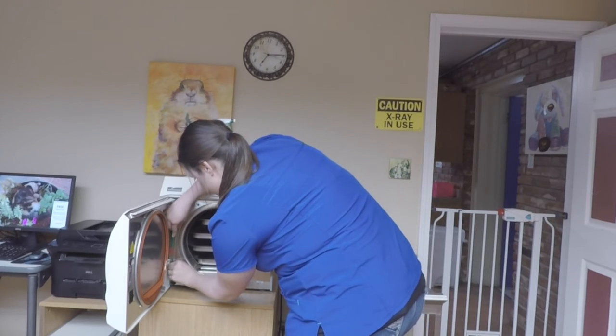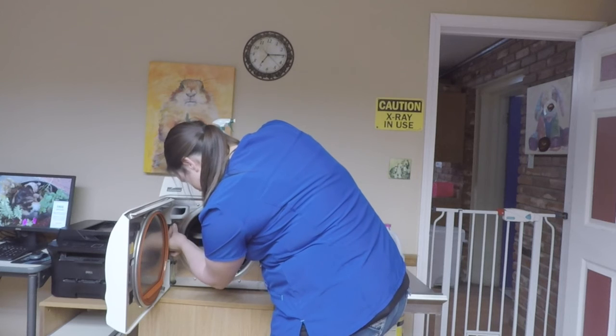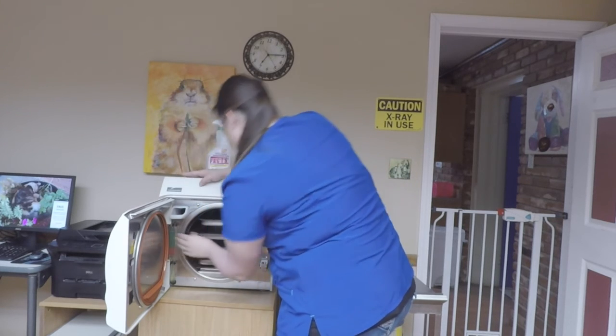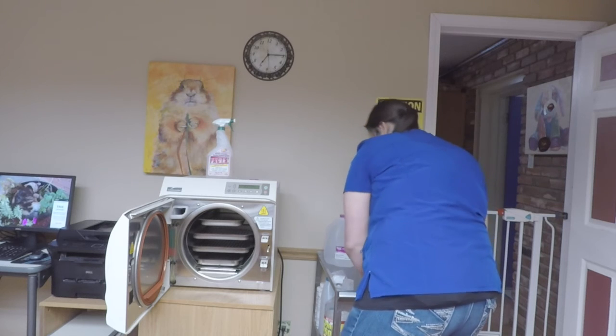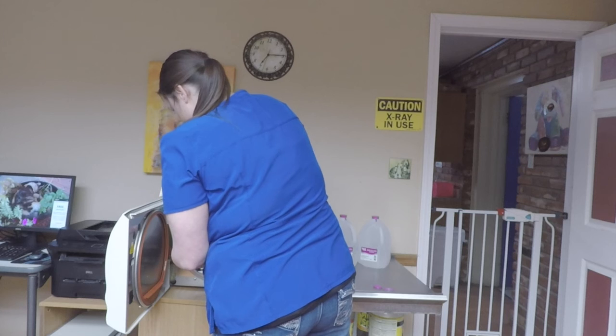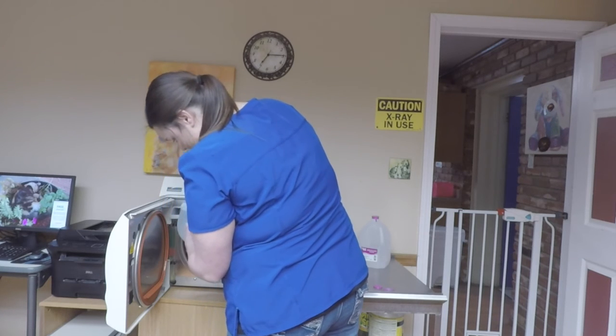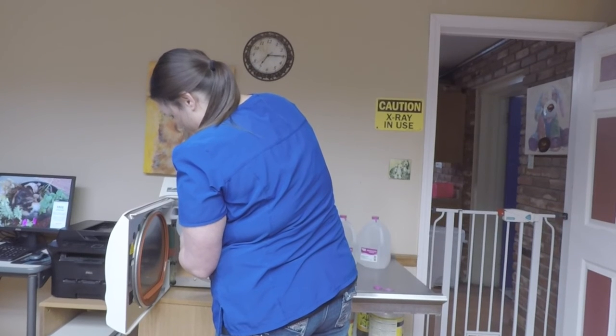You'll put your hose back in, and then to add water, you always want to use distilled water. You'll pour it into this little area here, and you want it to go up well into the green area.